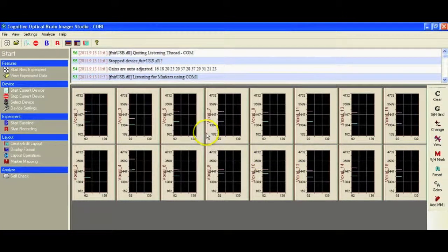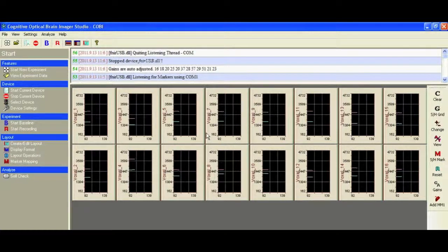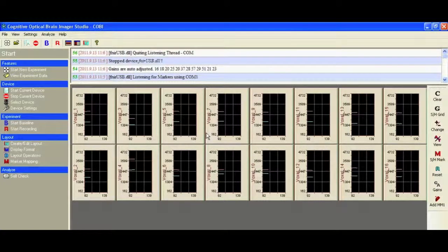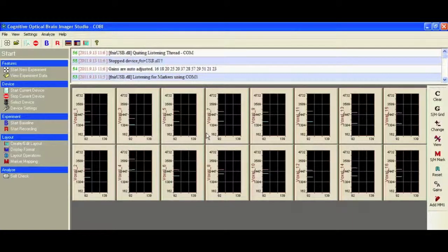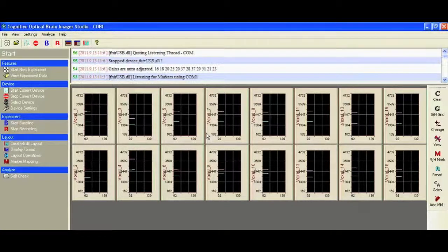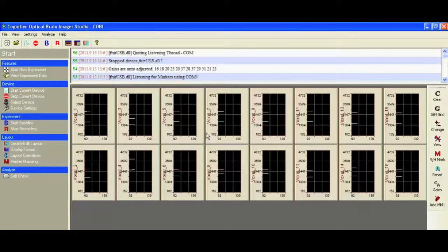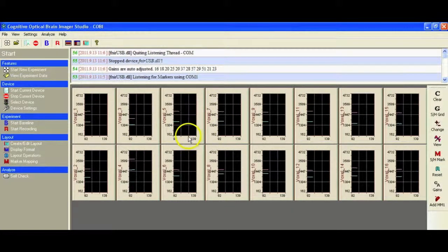All of this assumes that you have already connected your fNIR hardware to the computer running the COBI software using the USB cable that is attached to the device. You also need to have the sensor array connected to the unit, to the two connectors labeled 1 and 2, and preferably having the sensor array on a subject. I've got a subject sitting next to me with the sensor array attached to their forehead, and we should be at this point ready to go.